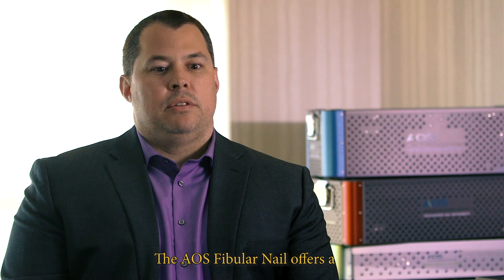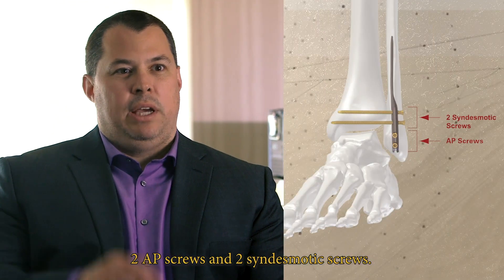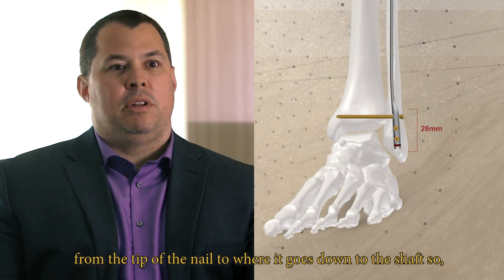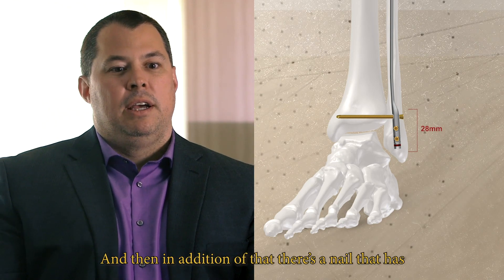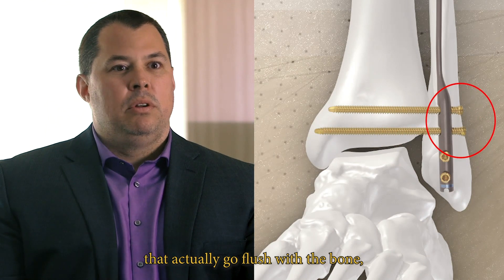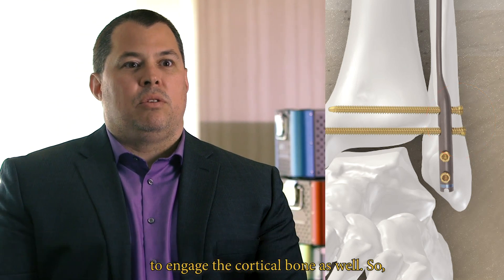The AOS Fibular Nail offers a multitude of different locking options. Current industry standard nails have two A-to-P screws and two syndesmotic screws. With two A-to-P lockers and one syndesmotic, the AOS design achieves only about 28 millimeters from the tip of the nail down to the shaft — significantly different from anything else on the market. There's also a configuration with two distal A-to-P locking screws and an oblique option. The screw heads are designed to go flush with the bone, countersinking into the cortical bone and engaging it with threads on the head.